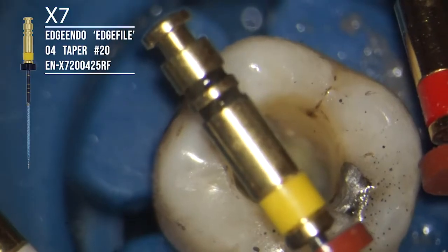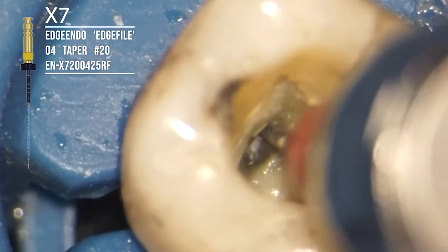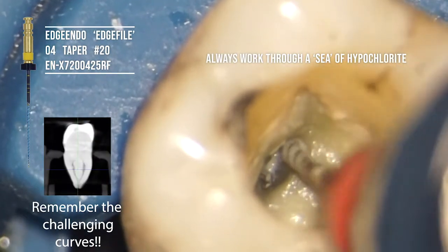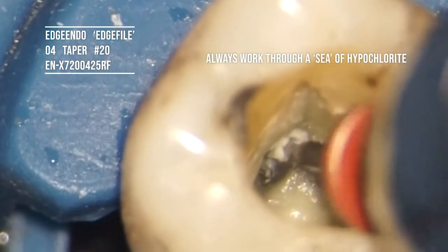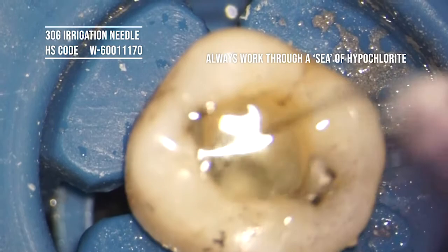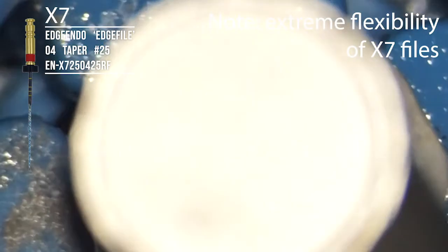Now the 04, size 20, first in our series. Look how flexible these files are. Literally, they just slide to working length and preserve that pericervical dentine just beautifully. Remember, always I should be working through a sea of hypochlorite. I just wanted to demo the really nice ability of the files. And look here how flexible this file system is.